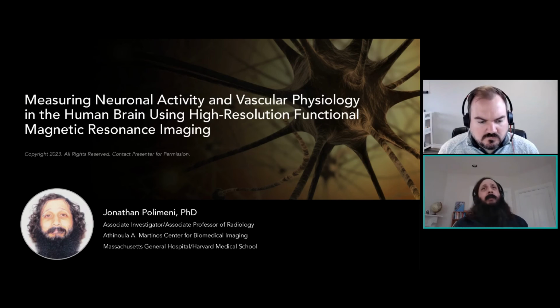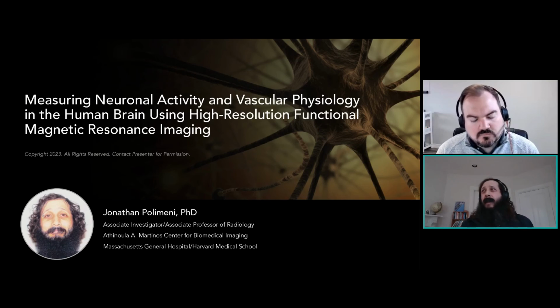Visual activation, for example, in this multi-site trial that we did for the CAA drug treatment, I think there were maybe two runs of about 6 minutes each. That was also very robust.